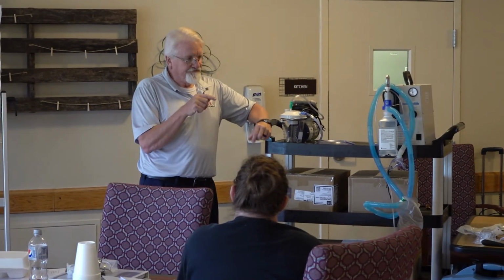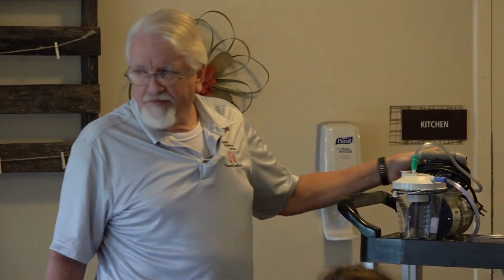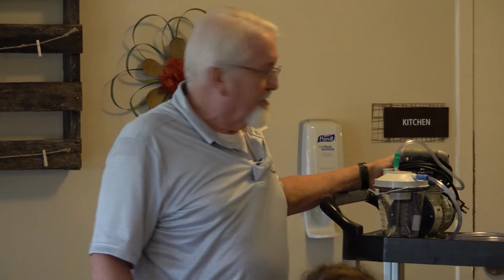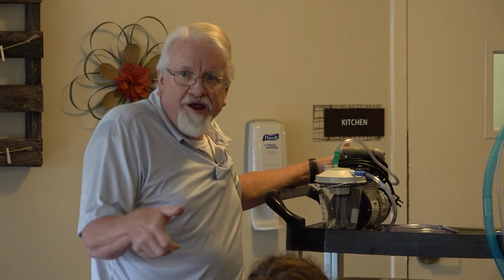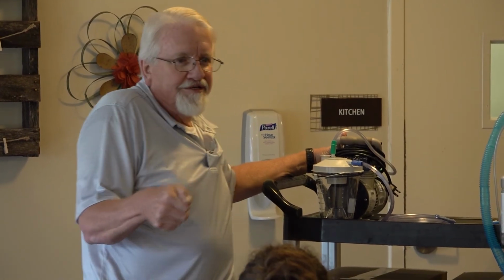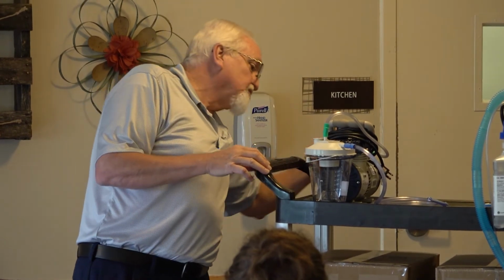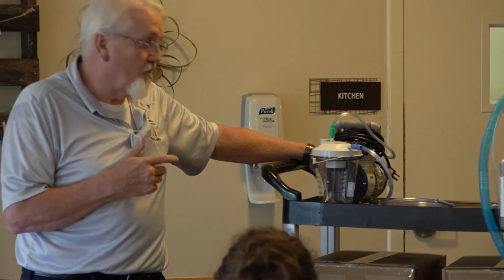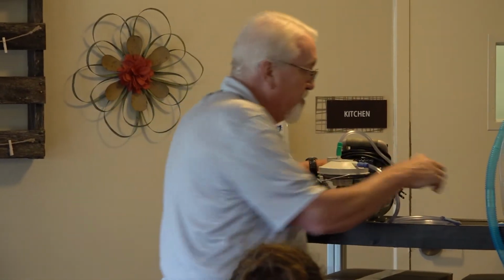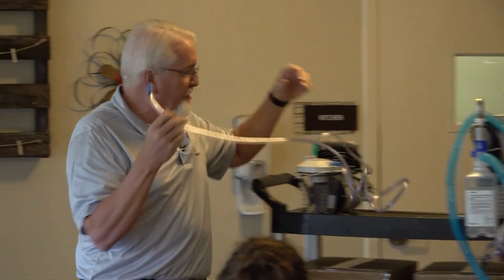So, our suction device. While I'm explaining to Bob what I'm getting ready to do, I'm going to nonchalantly make sure my compressor's turned on. The last thing I want to do is get the catheter all the way down in there and think, oh gosh, I forgot to turn it on. And I've seen that happen. So we're going to make sure that the compressor is on and running.